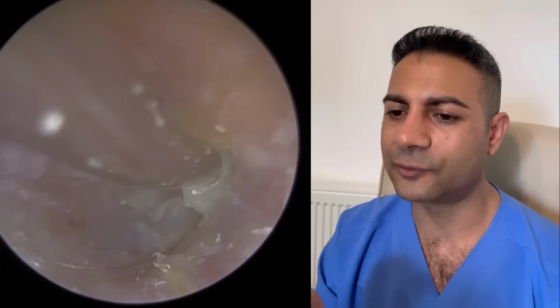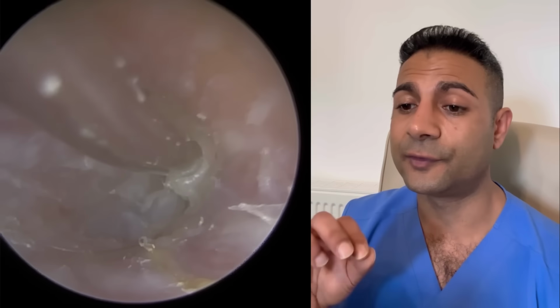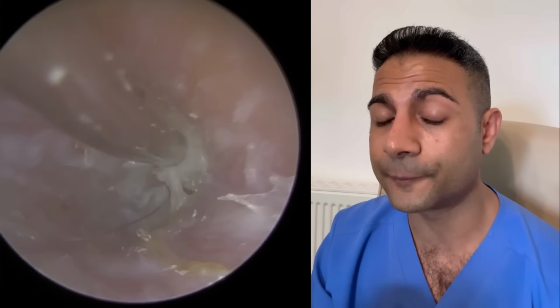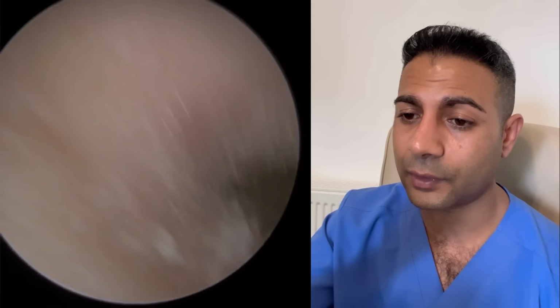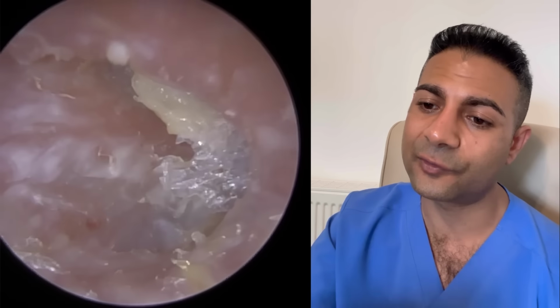And we've got to be careful, because when it is inflamed and swollen like this, it's a lot more sensitive. So if we catch the skin, we're more likely to cause a laceration and possibly some bleeding and blistering. So just be really, really gentle. I'm using the fine end suction probe. So I've curved the tips, I've bent it slightly so I can get access into that anterior recess.